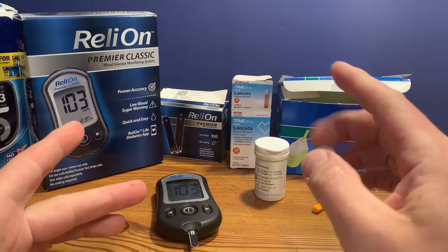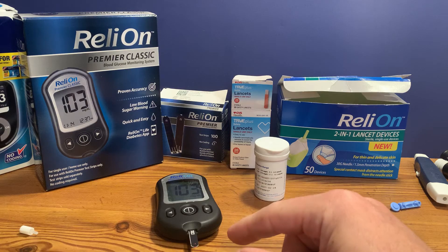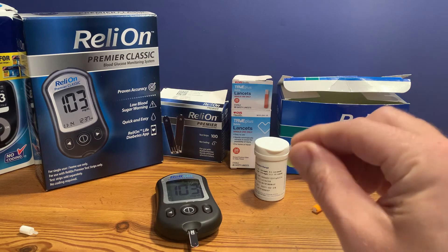I do have some videos showing what those readings mean. Typically, type 2 diabetics or pre-diabetics are going to want to take readings fasting, or first thing in the morning.